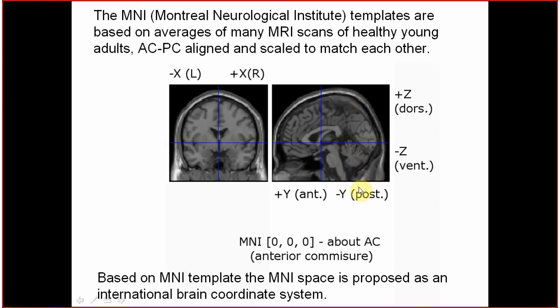The last coordinate is Z. It is a vertical displacement: a positive Z value is above the anterior commissure, and negative Z is ventral to the anterior commissure. The 0, 0, 0 coordinate is approximately at the anterior commissure, but not exactly.